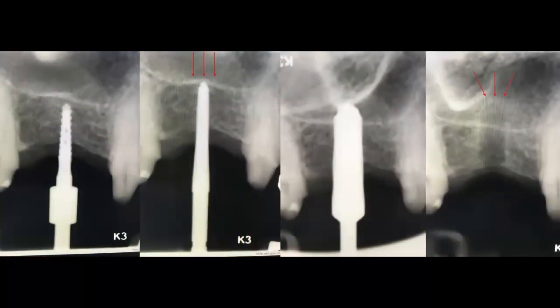And again, as you're seeing here, I'm going to use a combination of the Zimmer proprietary drills and the Versa drills. The Versa drills are drills that, when used in reverse, you can use for osteodensification and to create what has been published in the literature as the sinus bump, which is pushing a little bit of bone from the walls of that socket into the sinus and working on an internal sinus lift or sinus elevation, in order for me to be able to place a longer implant than I would have been able to if I did not use this technique.